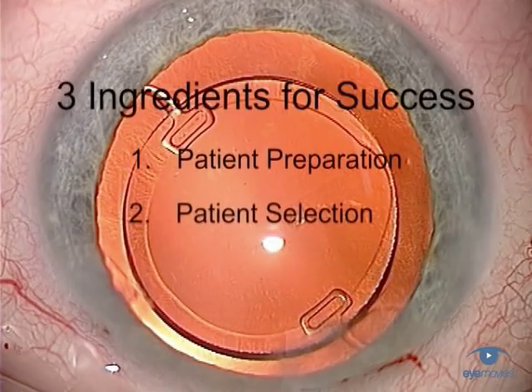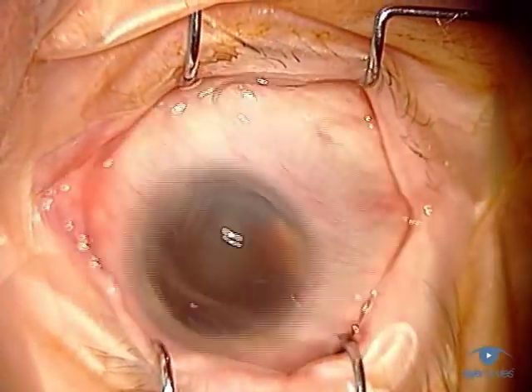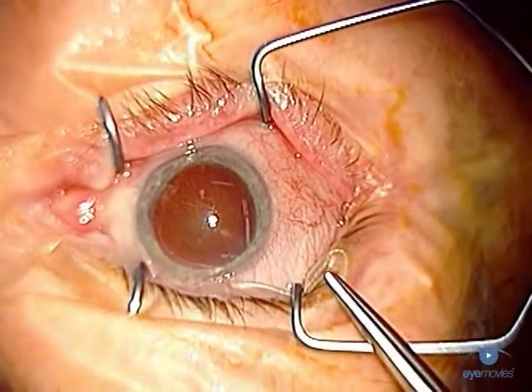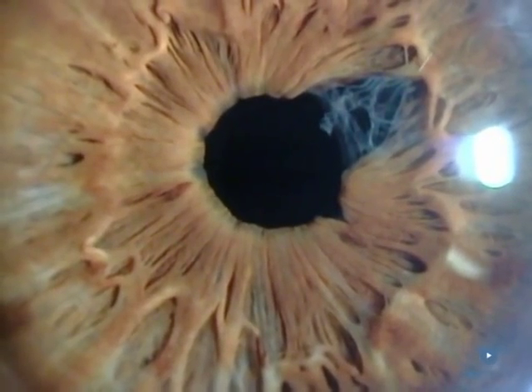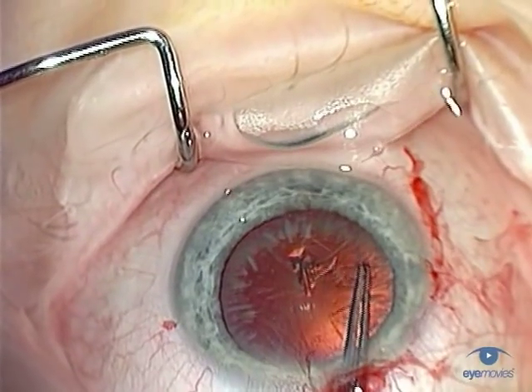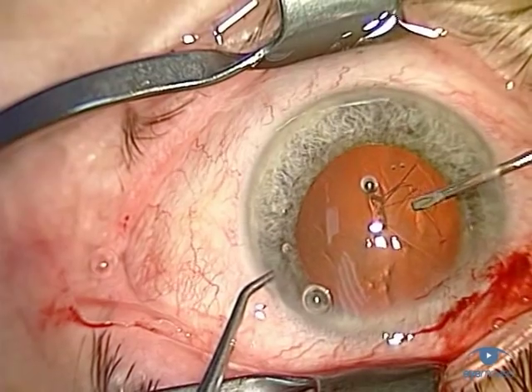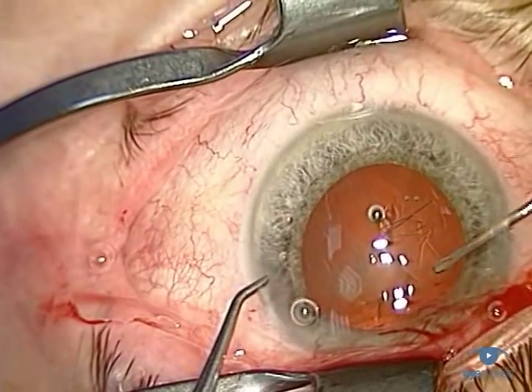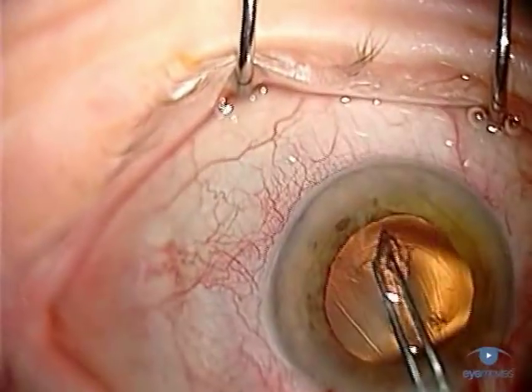Now to finish with, let's look at the preparation of the surgeon. The surgeon needs to be aware of three specific intraoperative issues: eye movement control, the intact sensation of periocular tissues, and the sensitivity of the iris to surgical trauma. Let's look at them in order. Firstly, eye movements. Although saccadic eye movements can look disconcerting, they can be readily overcome during critical maneuvers like the rhexis by immobilizing the eye with forceps. In contrast, sudden and more forceful gaze movements can cause problems.